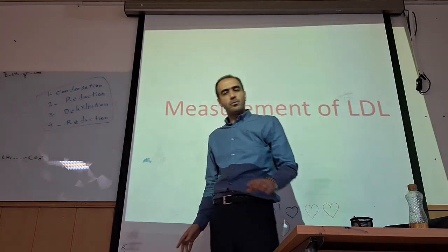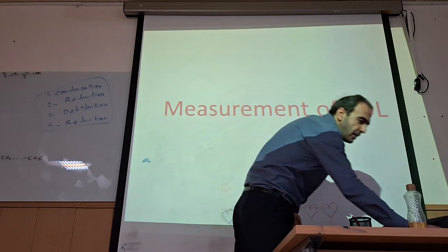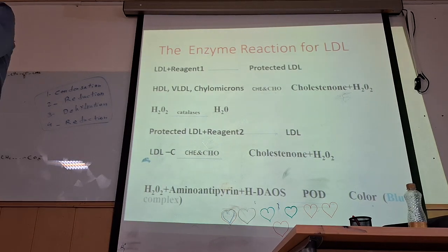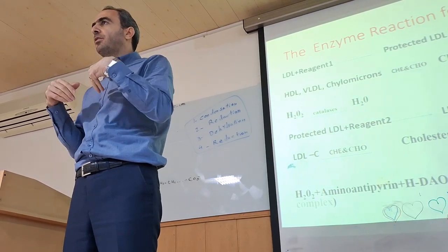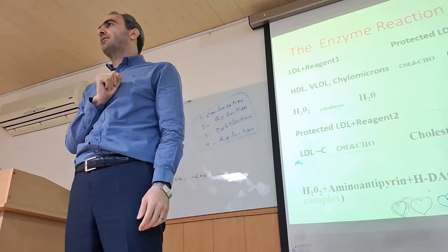For measurement of LDL, we have a different kit for measurement of different factors, different proteins, or lipids or amino acids in our body. We have to use a specific kit for specific factors.